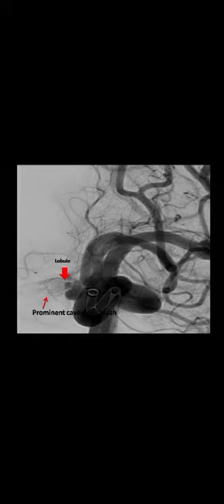And interestingly, we also have a prominent cavernous blush, which can sometimes be confusing in these patients. And this is the 2D image also showing the near the neck lobule. So we have shaped the catheter with two curves so it pointed naturally into the parent vessel. You can see the arrows point to the two curves.